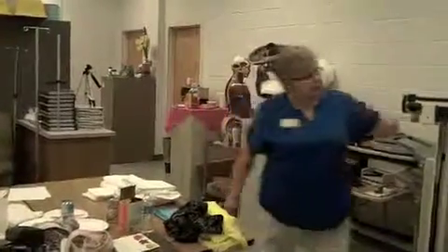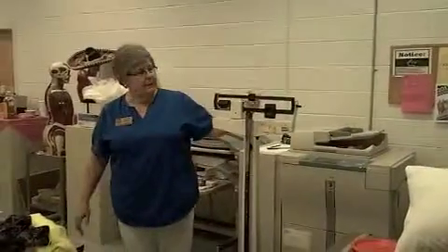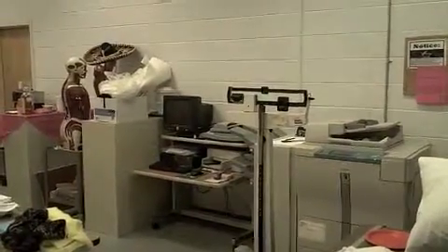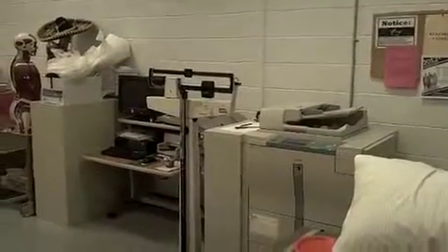All right, the scale is going to be off balance when your student comes up there. It'll be somewhere where it shouldn't be. And in this one, the patient can walk. It's not a problem. You don't have to help them to walk or anything. They don't need a gait belt. Some of them kind of turn into an ambulation skill when it's not. All right, Miss Beth, we just need to check your weight this morning.